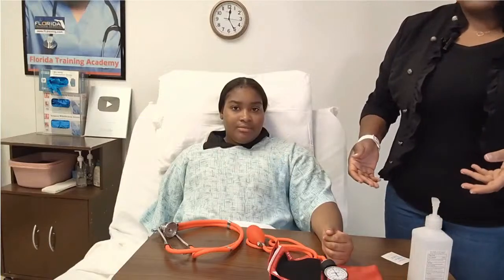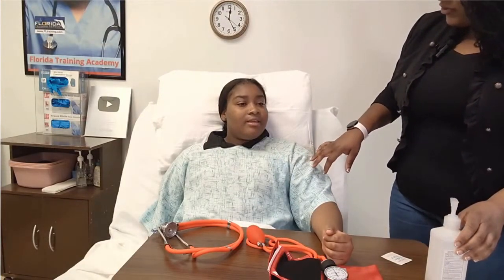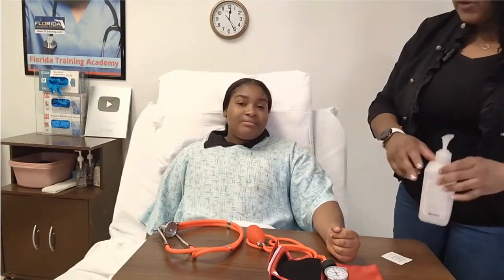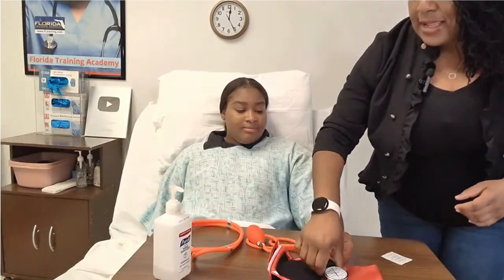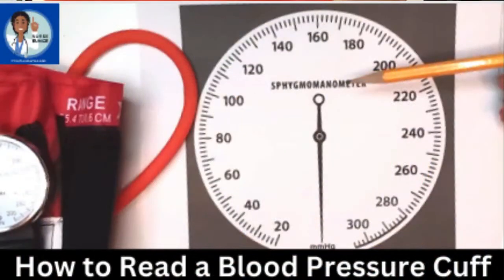We don't want you putting dirty equipment back in your care. One thing I always like to do is ask, 'Is it okay if I take the blood pressure on a particular arm?' So Anija, can I use your left arm? Yes. We're going to go ahead and place the blood pressure cuff or the sphygmomanometer. I do have another video showing you how to read the device — check the description area for a separate video link.